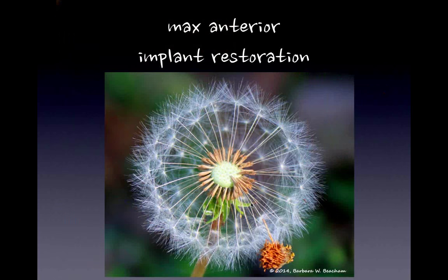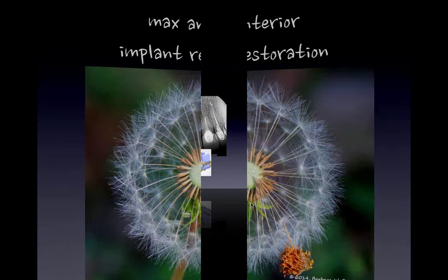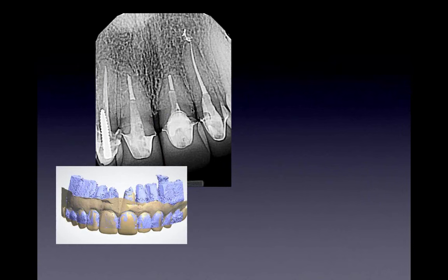And now we're going to finalize our presentation with our maxillary anterior implants. Now, for those of you who haven't done implants in the anterior, it's very challenging, but I'm going to show you a couple little techniques that really work for the implant restoration and the provisional. If you're thinking about putting an anterior implant in and want to make the patient a tooth in the same day, the three major rules are there's got to be a buccal plate. So in this patient, there has to be a buccal plate before we extract this tooth and put the implant. With no buccal plate, we can't do immediate. That's rule number one. Rule number two is that there's no occlusion on the provisional.